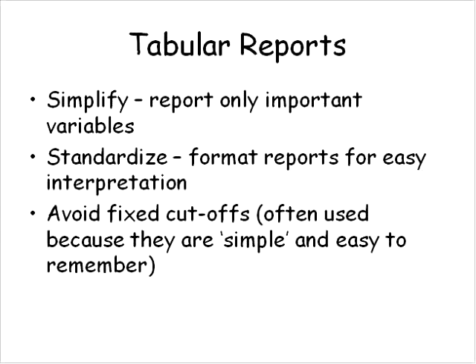So in terms of the absolute order in which you can do those tests, I don't think that there's any gold standard guideline for that, but I think it's probably a useful thing to do the spirometry first, because that's the most standardized part of the test that we're doing in terms of making sense of the numbers for interpretation, particularly the FEV1. If a patient is unable to complete the entire test, you probably want to make sure that you get spirometry first.